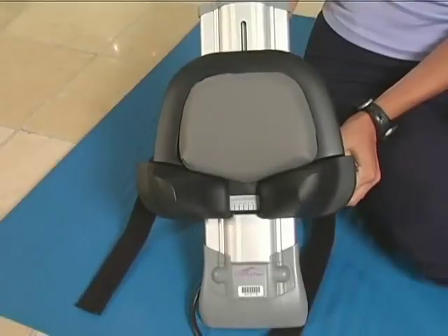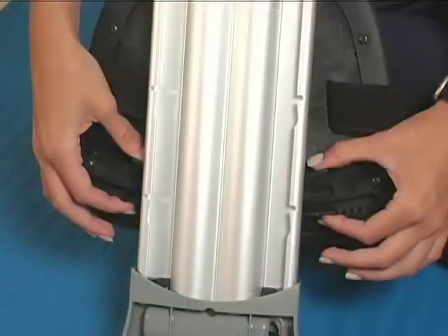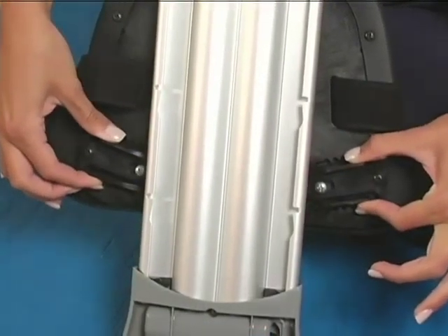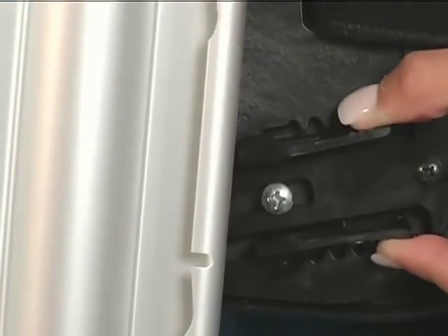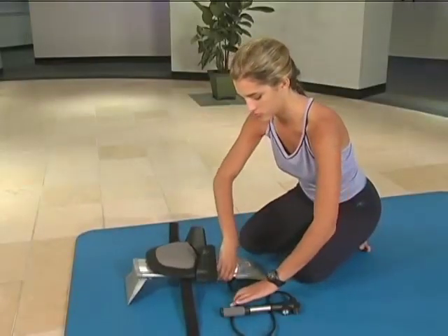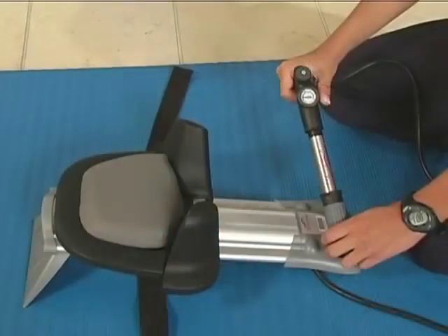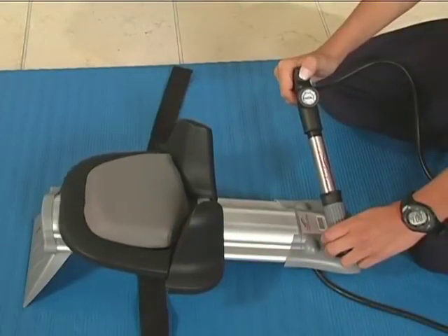Next, make sure the neck wedges are properly spaced as instructed by your healthcare provider. To adjust the neck wedges, pinch the adjustable clips located underneath the unit, then slide the neck wedges to the recommended setting. Make sure you have enough room to stretch out and that the device is not resting on top of the air pump hose. Also, make sure the pump is easily accessible once lying down.